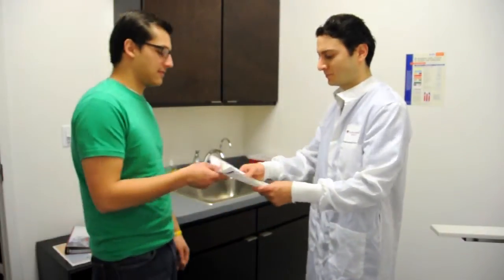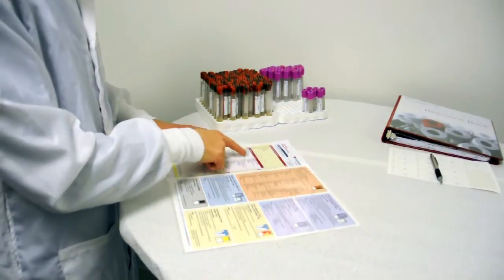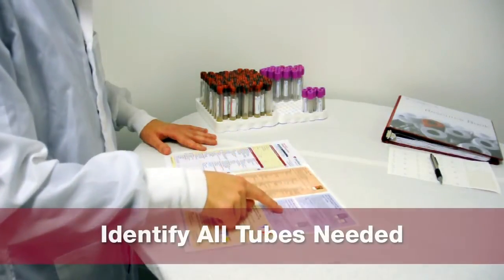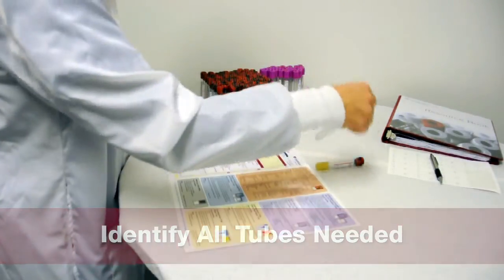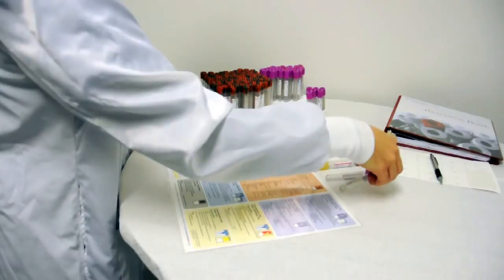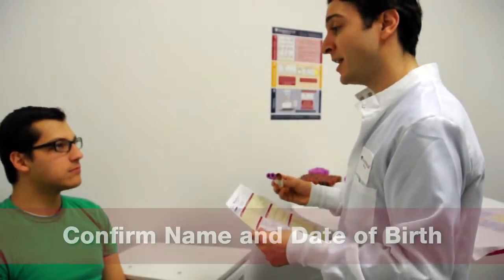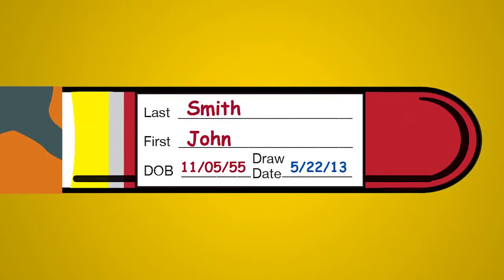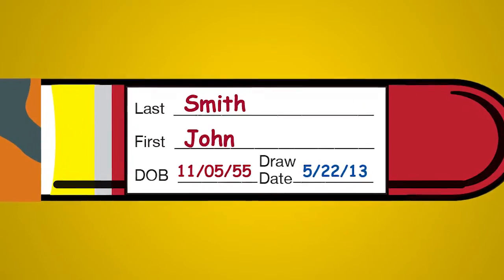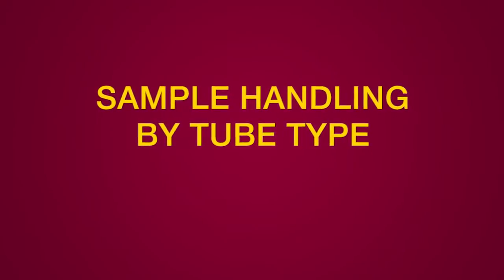You are now ready to draw the patient. Utilize the requisition form and sample handling quick reference card to identify all the tubes needed for the patient. Confirm with the patient their name and date of birth. After collecting the sample, label the tubes with this information and write in the draw date. We will now review the sample handling for each tube type.